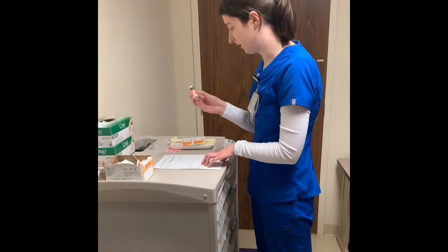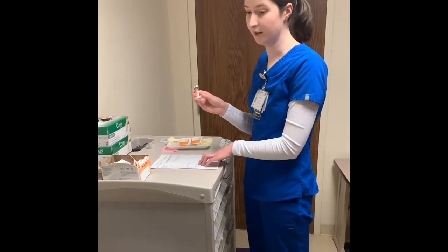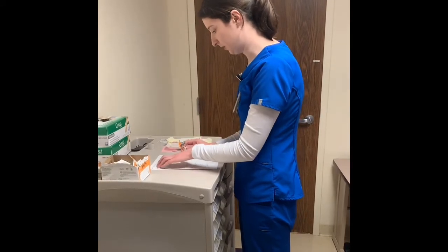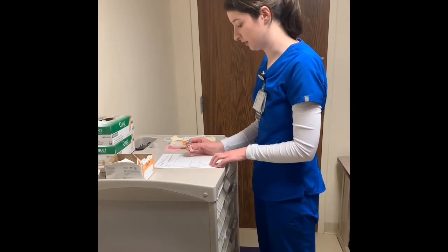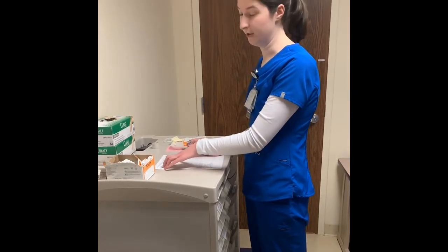I will be administering this subcutaneously in the lower right quadrant of the abdomen, assuming that there is nothing in that location that would warrant giving it somewhere else. According to the patient's most recent fingerstick blood sugar level being 355, I'm going to be administering 20 units of regular insulin at this time, and it is currently 1100.